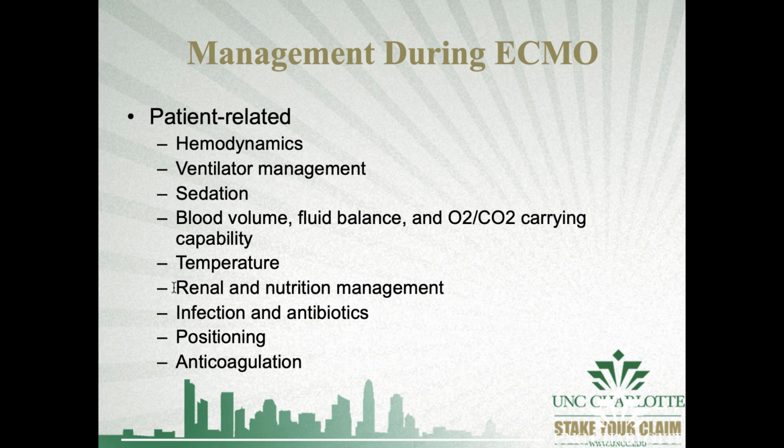This can also be representative of the movement of the cannula, and we have to get that assessed as well through some sort of ultrasound or Doppler. This is similar if we compare this to our endotracheal tube management, right? So we're very cognizant of these changes on our ventilator. It's the same thing with an ECMO circuit.